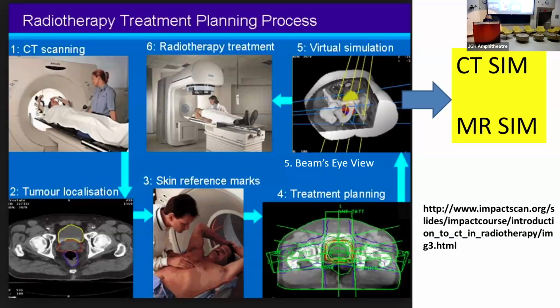This is a very old radiotherapy treatment planning process. Maybe I should have shown it at the beginning because I noticed there are not that many radiotherapy people here, but now we have it. This is the whole process, which is very critical. The part that's important for artificial intelligence is what's called treatment planning and MR sim, because that is where the physician delineates the tumor, delineates the critical organs, and they're able to get the patient's breathing. That's already done now. We use that data for each patient in our AI algorithms. So that's where we do the artificial intelligence.